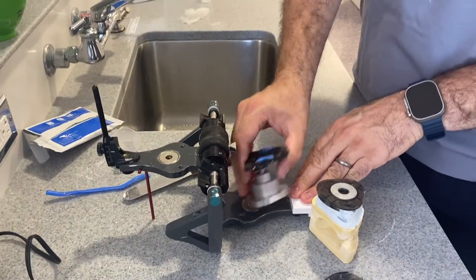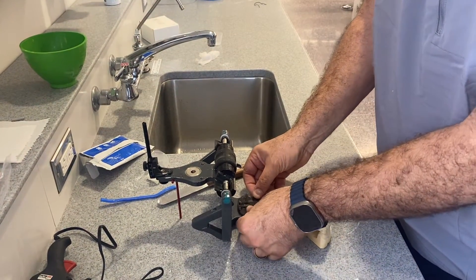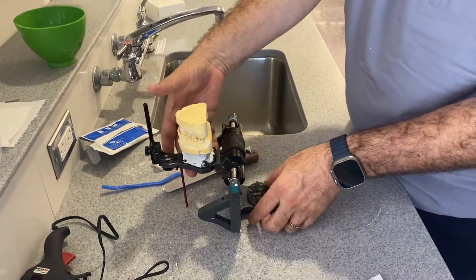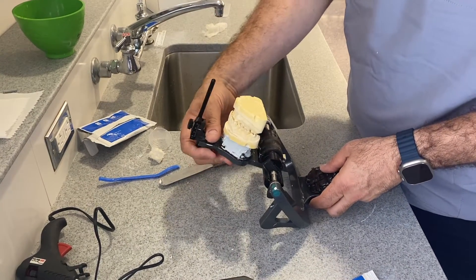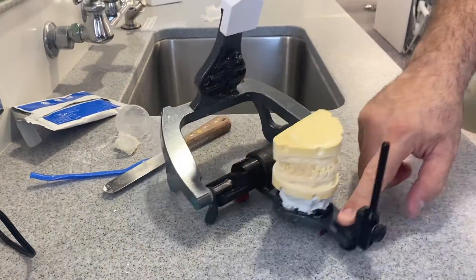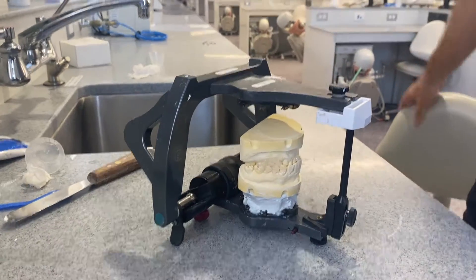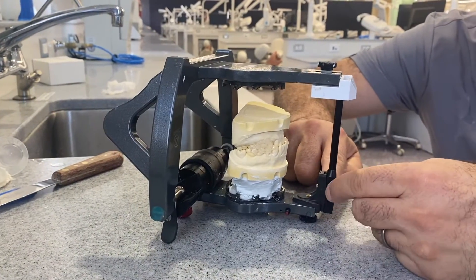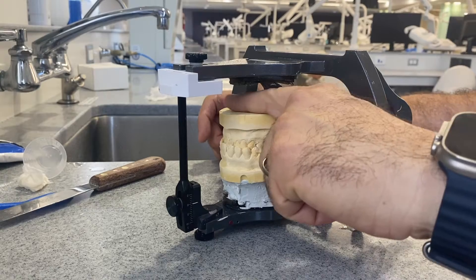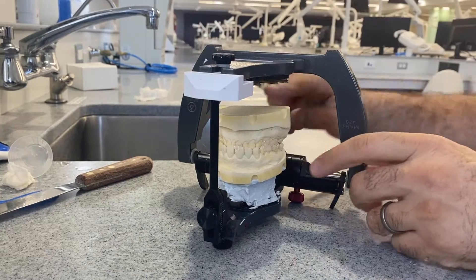At this point, I'm going to get the universal mounting table out and another mounting plate. I set the upper like that and then flip my articulator over. Now the upper part is hitting the table. I close it, making sure this is at zero and that I have enough space for the mounting stone. This is nice and secure and not moving anywhere.